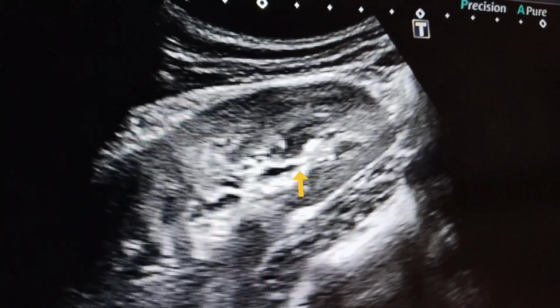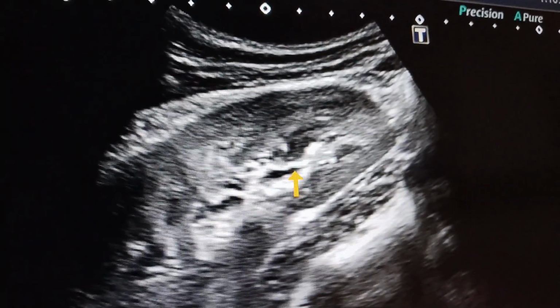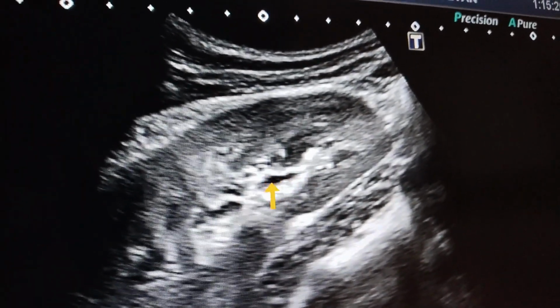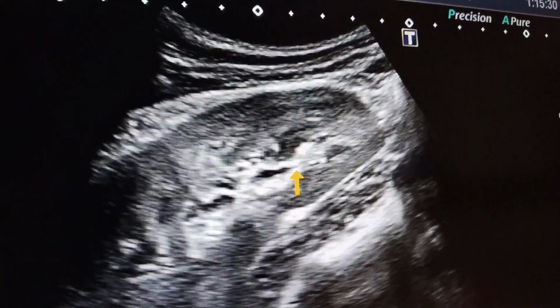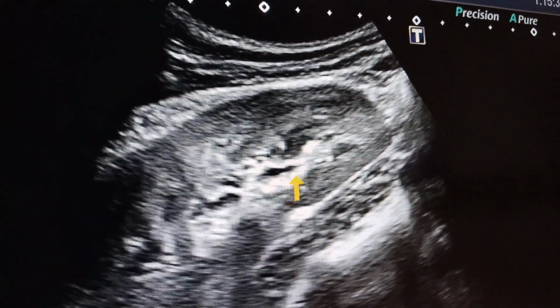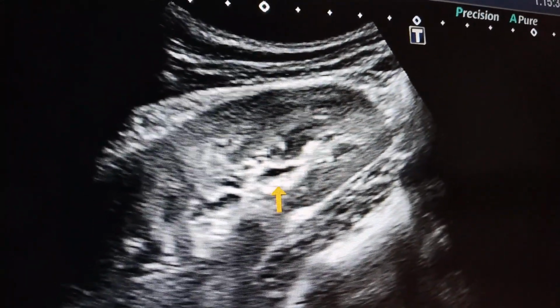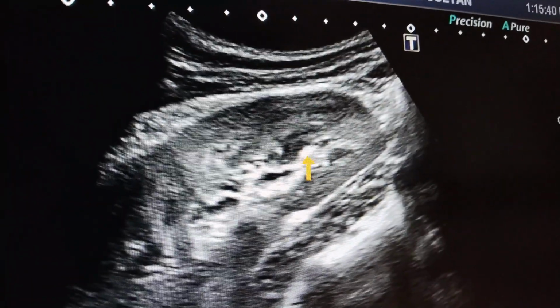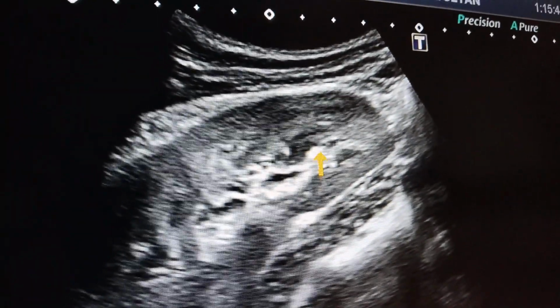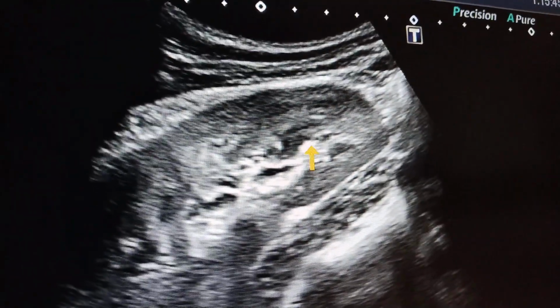This is the renal sinus fat which is surrounding the calyceal system. This black is the calyces. So this is surrounding this calyceal system, and also this may be the interfaces of many other things. This is the focus which is irregular in shape and it is producing twinkle artifact.